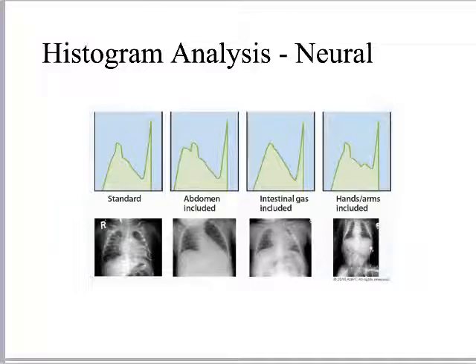So again, this is just a fancy way of saying if you shot a chest x-ray, tell the computer you shot a chest x-ray, not a hand x-ray. The reason for that is simple, and I'm going to put it in really extreme terms, okay? So let's say we wanted a nice makeup job, right? But we got this, right? Now this is actually a good makeup job. It's a really creepy makeup job, but someone really spent some time doing this makeup job.